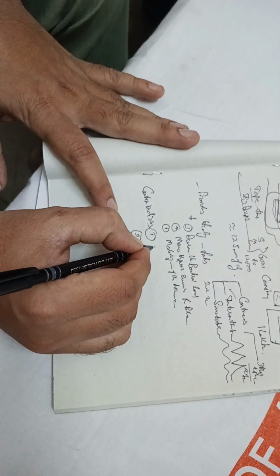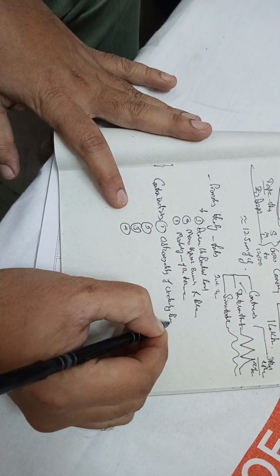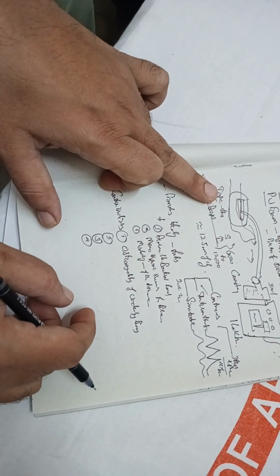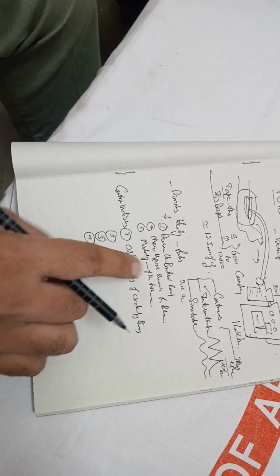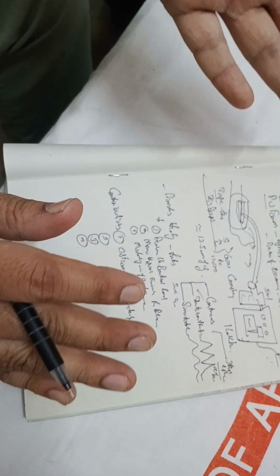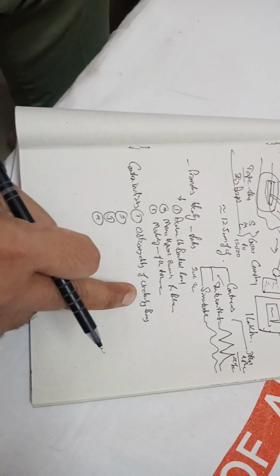First contraindication is osteomyelitis of underlying bones. So this is a wound, and there is a bone underneath anywhere there. So you need to take an X-ray of that part of the limb. If the bone is already having osteomyelitis, you better not do this, because overlying granulation will be there, but underlying pathology will still be there. So it will not serve the purpose. So osteomyelitis of the underlying bones is a contraindication.